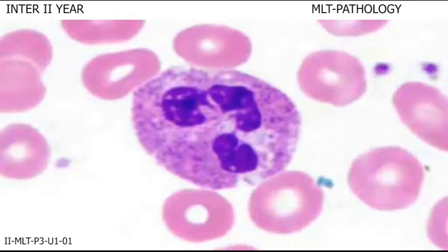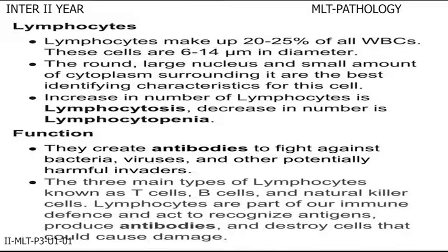This is the microscopic view of neutrophil. The nucleus is divided into four lobes; the lobes are sometimes more than four. Lymphocytes make up 20-25% of all WBCs. These cells are 6-14 micrometers in diameter. The large round nucleus and small amount of cytoplasm surrounding it are the best identifying characteristics of this cell. The increase in number of lymphocytes is called lymphocytosis and decrease in number is called lymphocytopenia. They create antibodies to fight against bacteria, viruses, and other potentially harmful invaders. They are of three types: B lymphocytes, T lymphocytes, and natural killer cells.